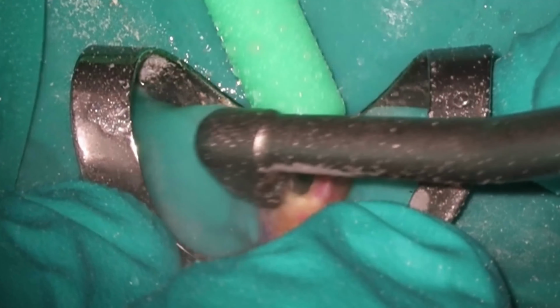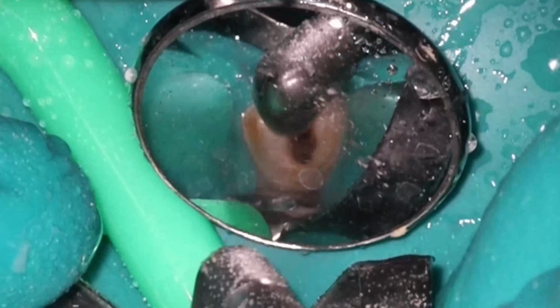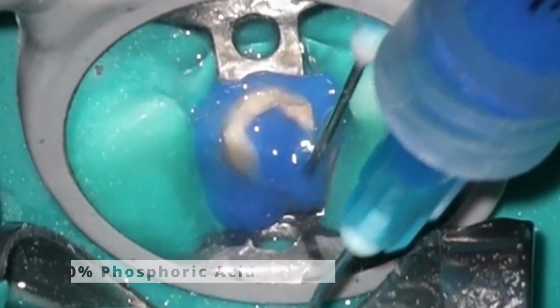The nice part of that blasting solution is it's going to get rid of any of the cement on there as well. Just create a really nice surface for bonding. The other thing you'll notice is I've left the rubber dam in place. And the reason I did that is because it almost forms a nice isolation for me at this point. So I'm not going to be using anything super fancy here besides just the rubber dam.